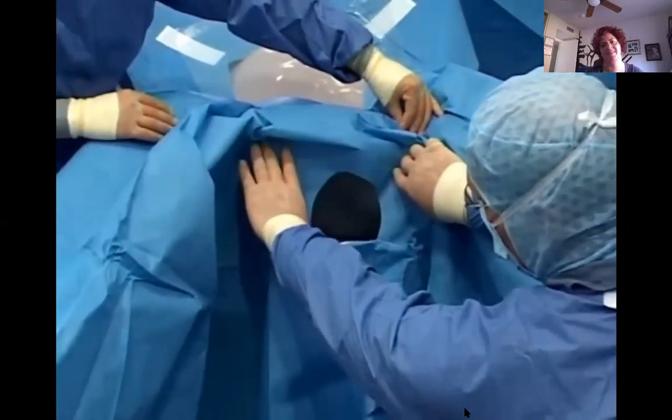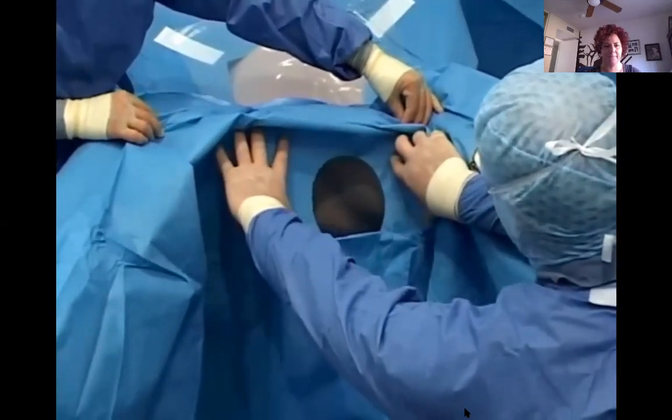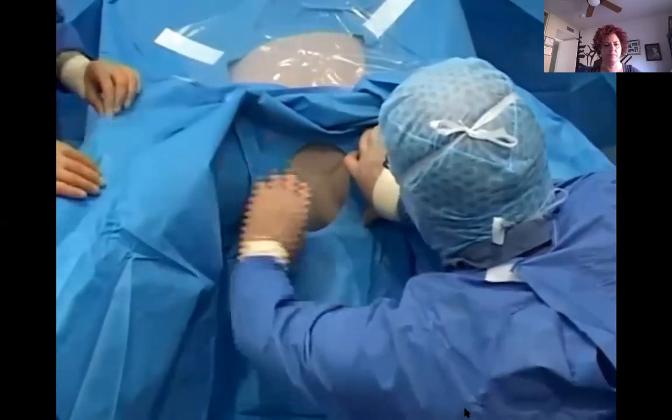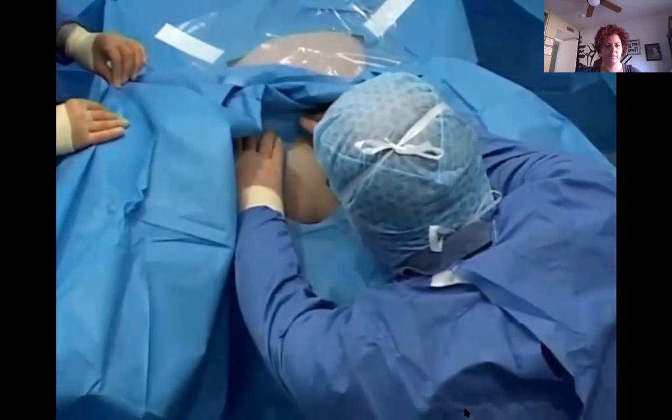Poor circulating nurse. The perineal aperture enables this drape to be used for a variety of different procedures. Finally, secure the aperture over the perineal area.